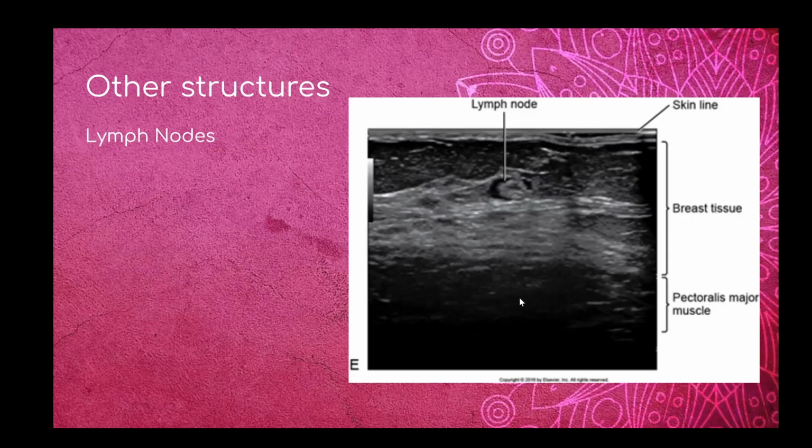Some other structures that are seen within the ultrasound are lymph nodes. We had a radiologist that would call patients back. They'd have their screening mammogram, come back for a diagnostic because something looked kind of weird, and they still couldn't get rid of this weird spot, so they would send us in. But he would always put it out there as, I can only see it in one view. It's probably a lymph node. And so you pretty much had to scan half a breast, because remember, we needed both views to be able to locate where it is by clock position. So he'd say, I can only see it in the MLO view, scan the upper half of the breast. We're like, cool, I'm just going to go search for a lymph node.